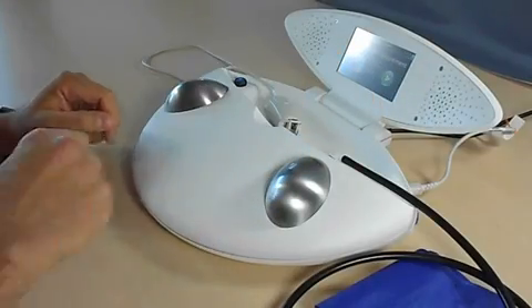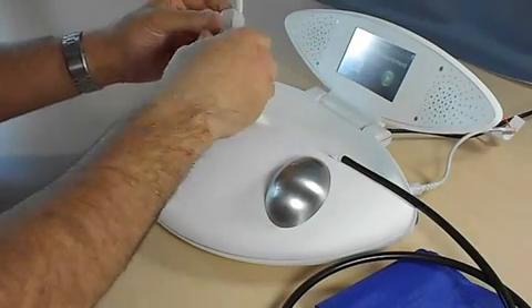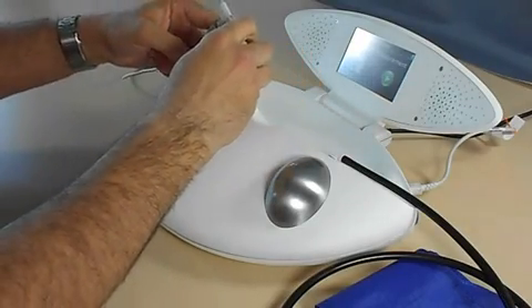Please put the finger clip on your left forefinger, then push the green start button on the screen.